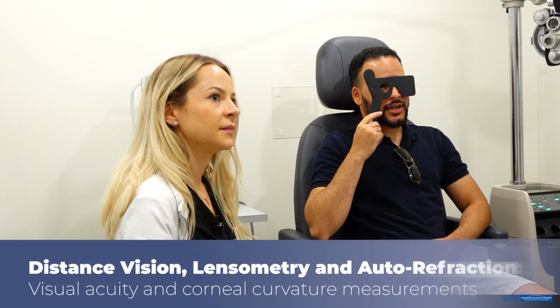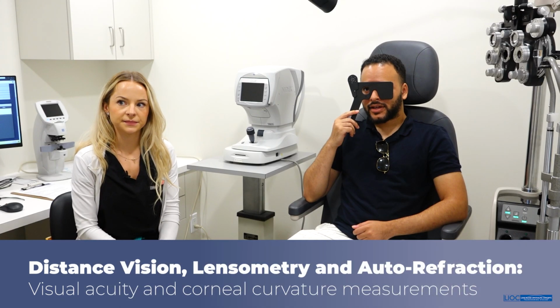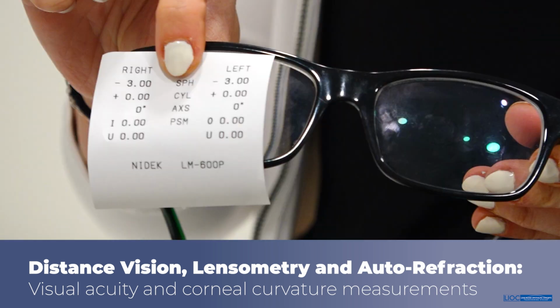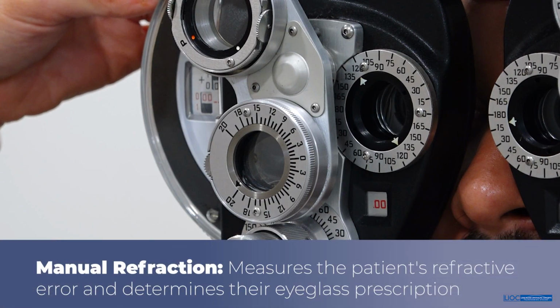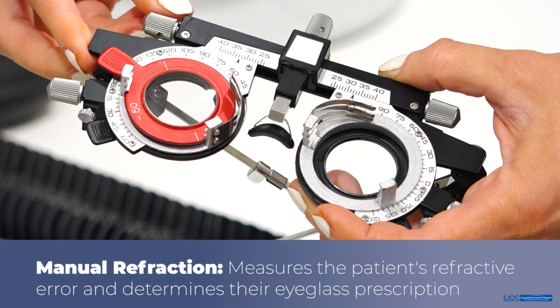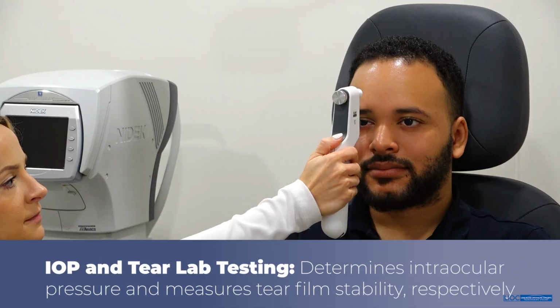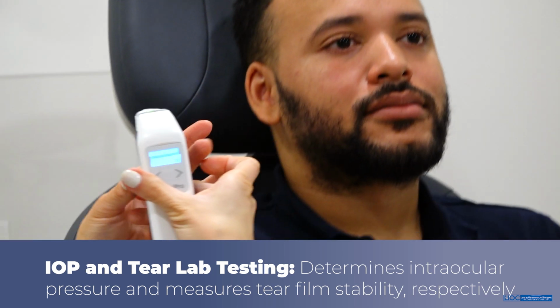2. Distance vision, lensometry, and autorefraction, which overviews the patient's distance visual acuity in their habitual glasses, measures the prescription in their habitual glasses, and obtains the corneal curvature measurements, respectively. 3. Manual refraction, which measures the patient's refractive error and determines their eyeglass prescription. 4. IOP and tear lab testing, which determines the intraocular pressure and measures the tear film stability, respectively.